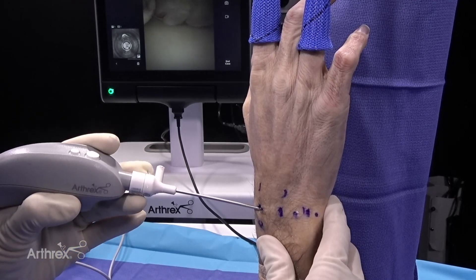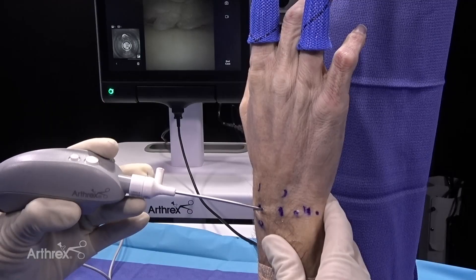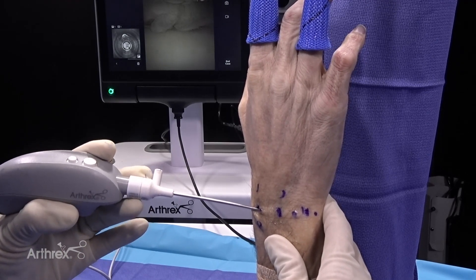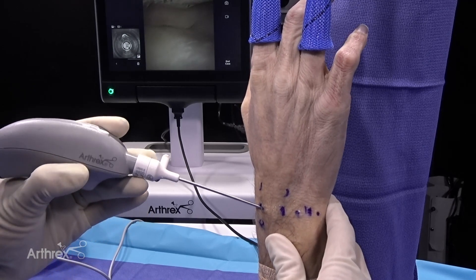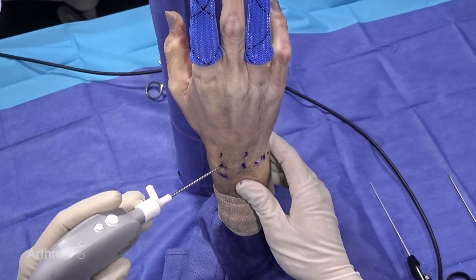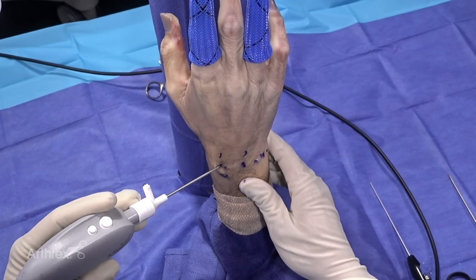As you insert it you can see the synovium on the volar side of the wrist. One of the really awesome things about the nanoscope is it has a flexible quality that standard wrist arthroscopy doesn't have — if you did that with a standard scope you would break it. The nanoscope has an amazing amount of flexibility that allows you to adjust your hand and see things you've never been able to see in an arthroscopic manner, comparable to direct vision in an open procedure.